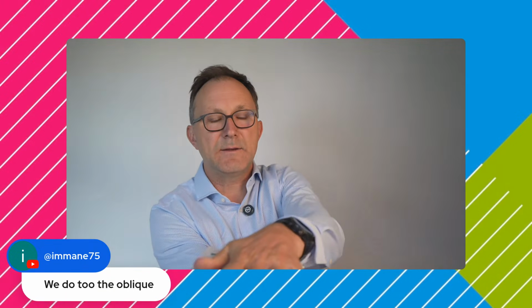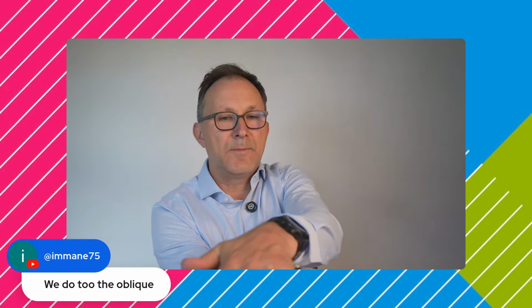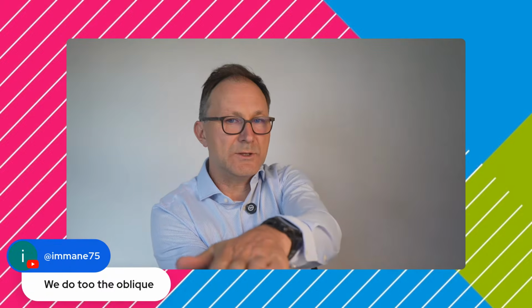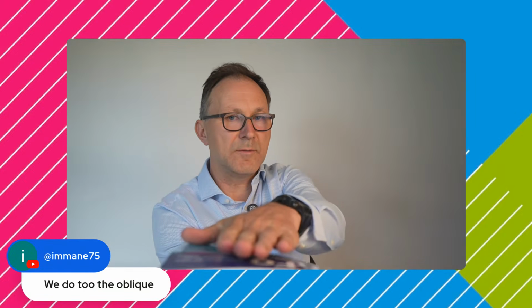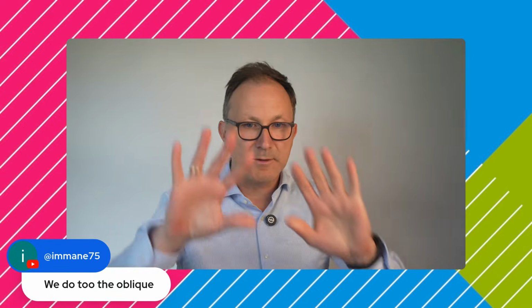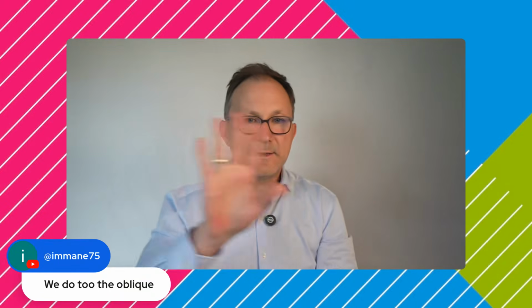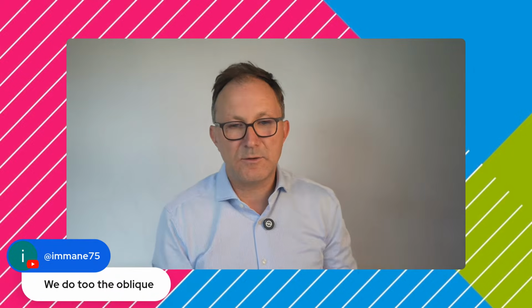You place the hand here and make the X-ray. You should pay attention not to make the fingers close to each other. You should spread them a bit, and you should not do both hands on one film. You should do just one hand and then the other hand, which gives better image quality. That's what you can see in today's session.